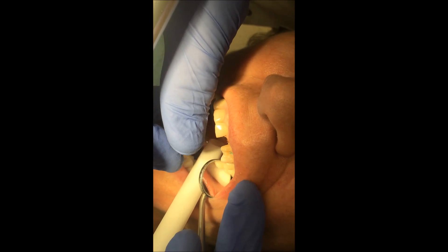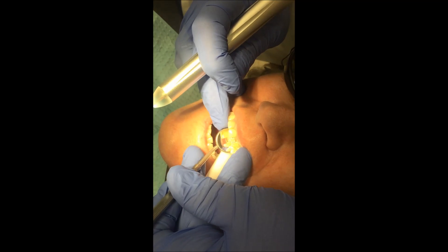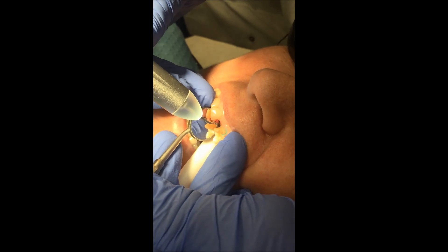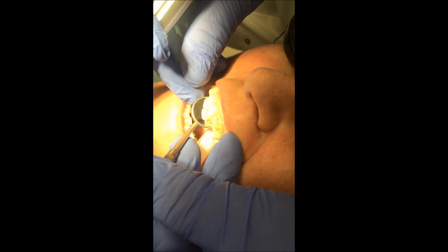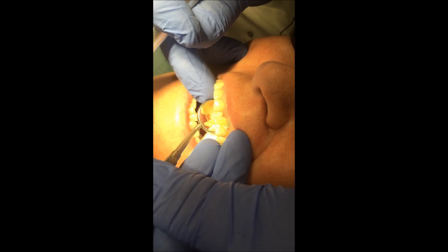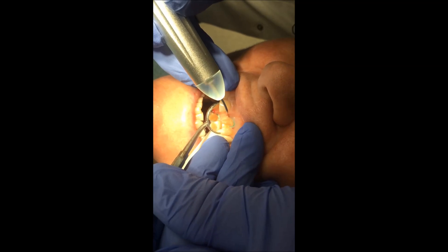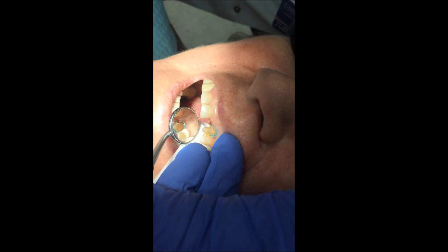Okay, let's put the laser on the tissue and go. You can see the tissue is reduced. Let me take this little spot right up here — a nice smooth surface, no bleeding, and no postoperative pain.